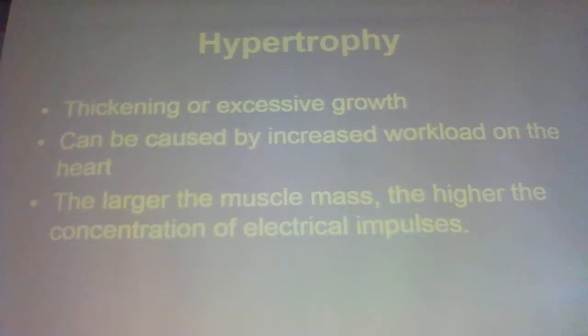All right. What's hypertrophy? Enlargement of what? Specifically, it's thickening. Thickening of the wall, right? So think this through. The thicker the wall, the longer it takes for electricity to go across it, right? So what's it going to look like on the EKG? Big long sucker, right? But is it wide or narrow? Narrow. Narrow, correct. What causes, like specifically left ventricular hypertrophy?